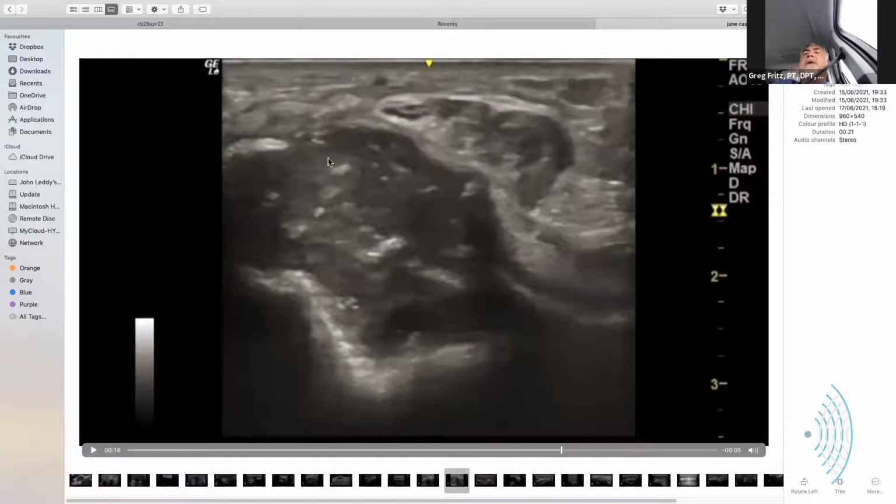We're medial there? Yes, that's a soft tissue. That's where the medial epicondyle should be. Yeah, and that is soft tissue. So that's what metastasis looks like. Is that right? And is it eroding the bone itself? No, it is in the bone. It's replaced the bone there.